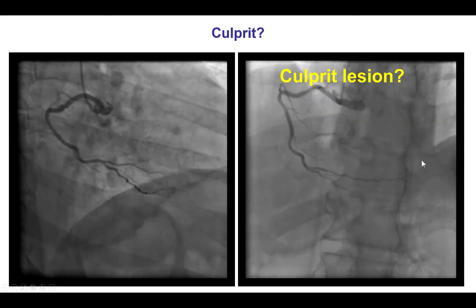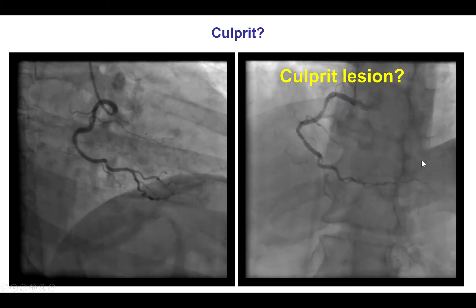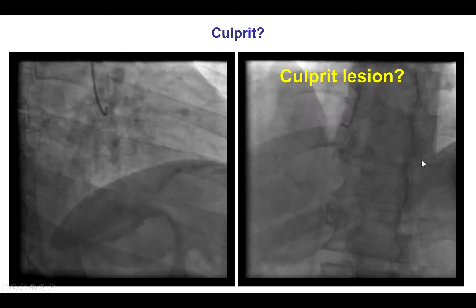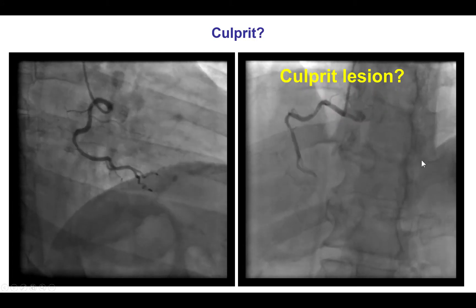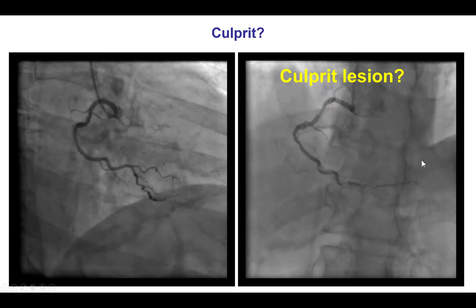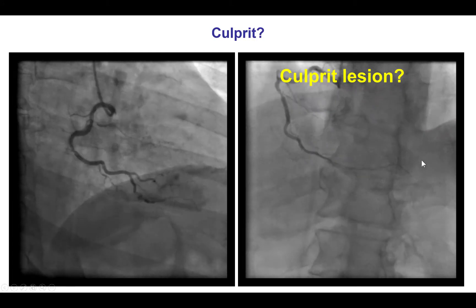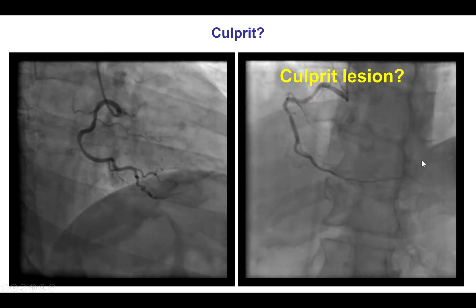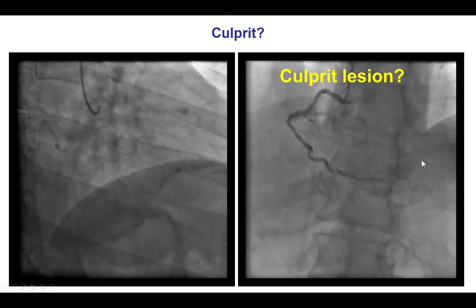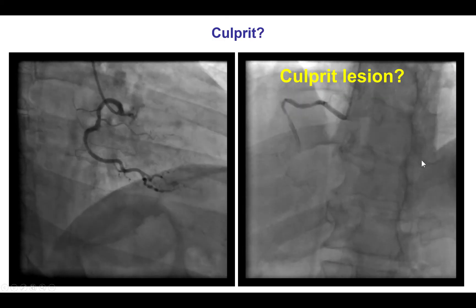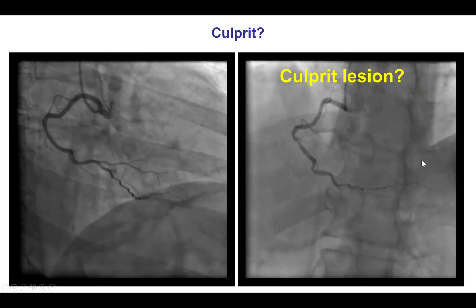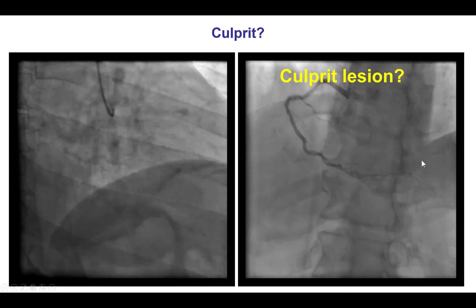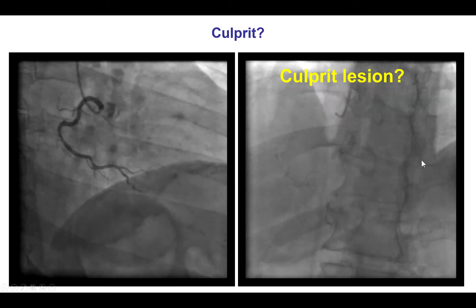After imaging the left coronary artery, we performed angiography of the right coronary artery. However, to our surprise, that was a small non-dominant vessel without any significant lesions, therefore leaving the question of the culprit vessel still open.